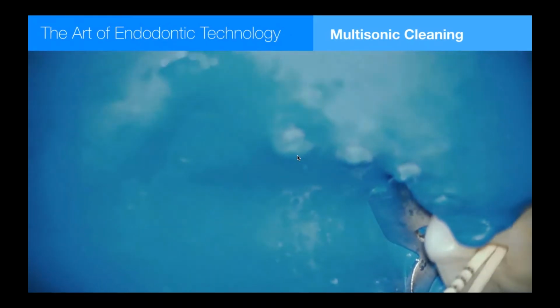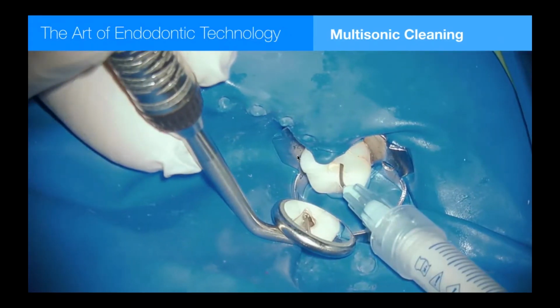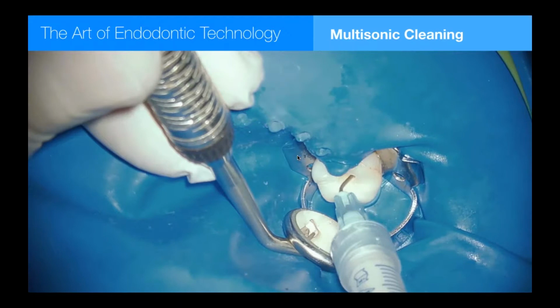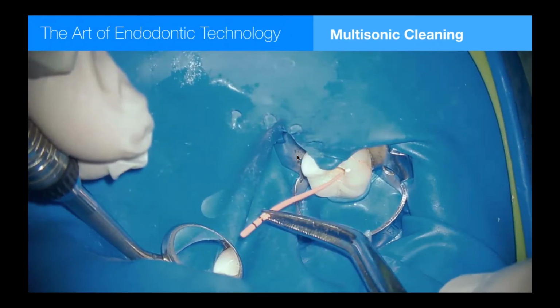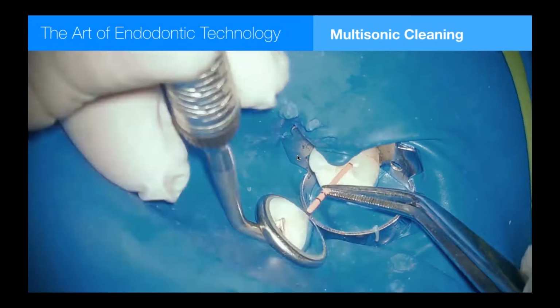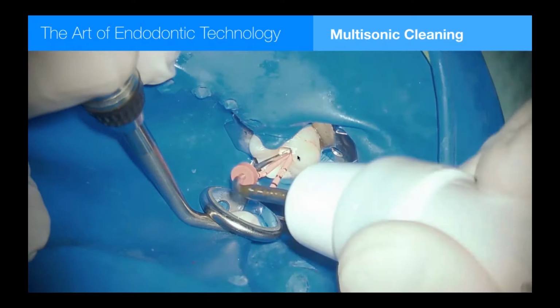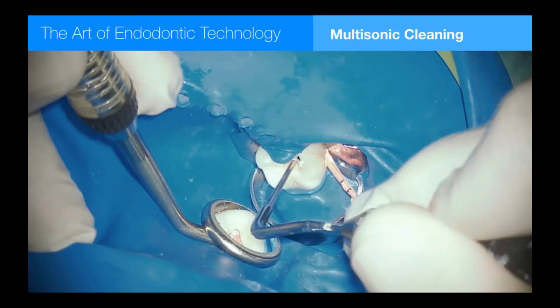I know a lot of endodontists don't use carrier-based obturation. I think it's fabulous. It has a broader applicability than cone fit techniques. And basically, endodontists should use carriers when they can't fit a cone. So the irony of carrier use by endodontists is most endodontists think it's an inferior way to fill root canals. But the best case for an endodontist to learn about it is the longest, curviest, worst anatomic challenge they've seen in the last 6 months. Put a carrier in that and you'll find out the value of it.